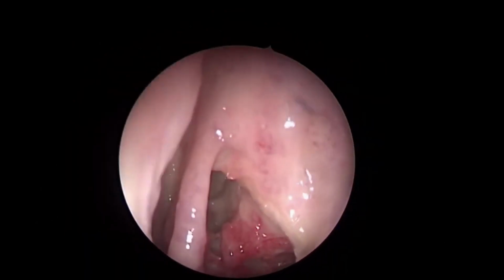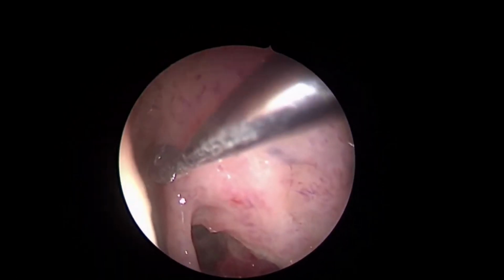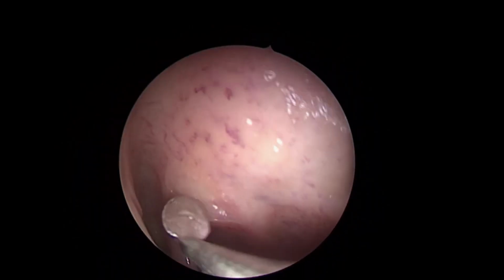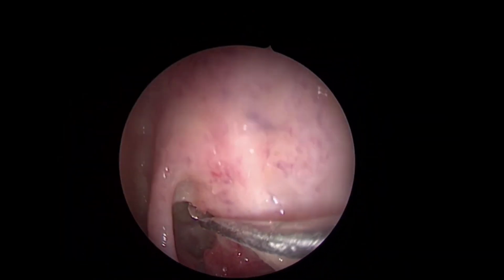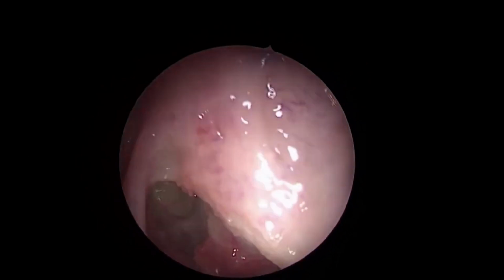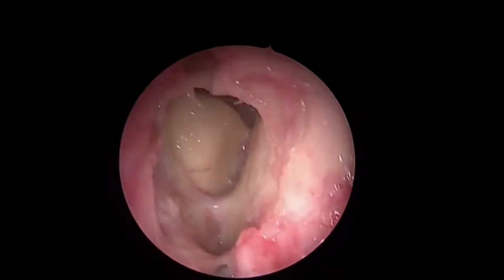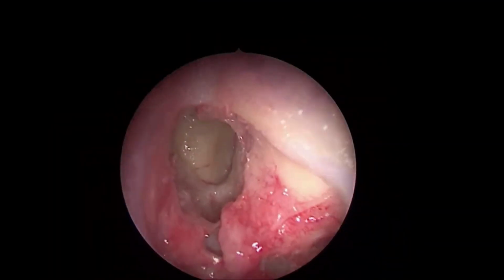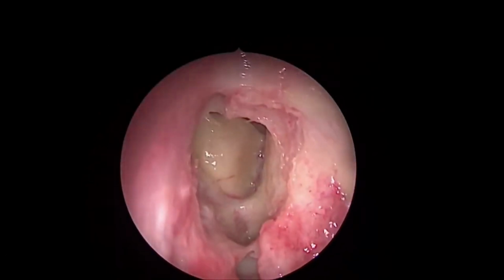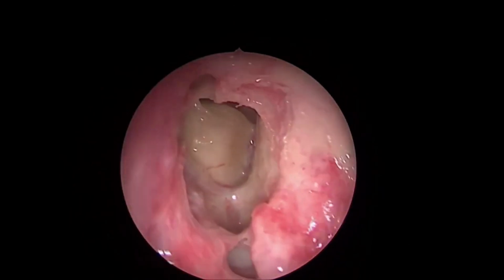So what exactly does he do? He raises a flap of this region like this. I raise a flap here. I am not raising it, just to show you. Elevate it towards the turbinate, and then take away this bone of the axilla, so that the hindrance to the frontal entry is gone, and you can enter into the frontal a little easier than otherwise. The fundamental behind that approach is to facilitate your entry into the frontal much better, but still it cannot beat the 70 degree. If you have a 70 degree, you don't need to do all that. Okay.